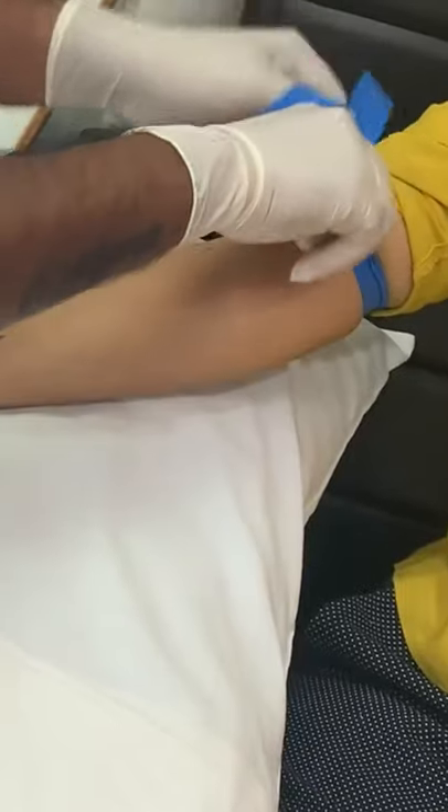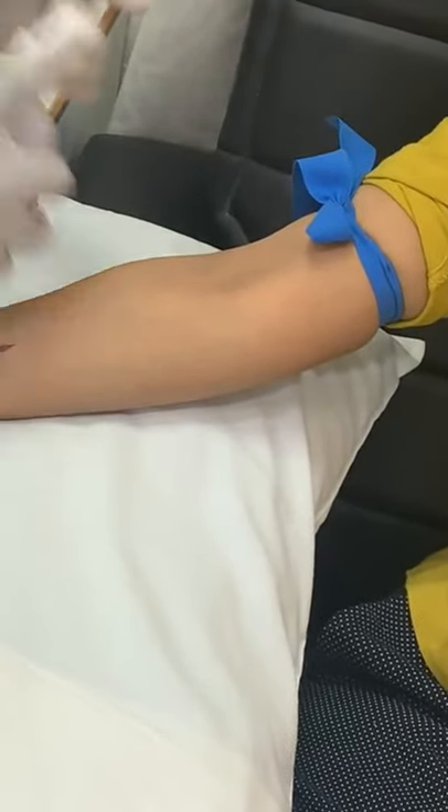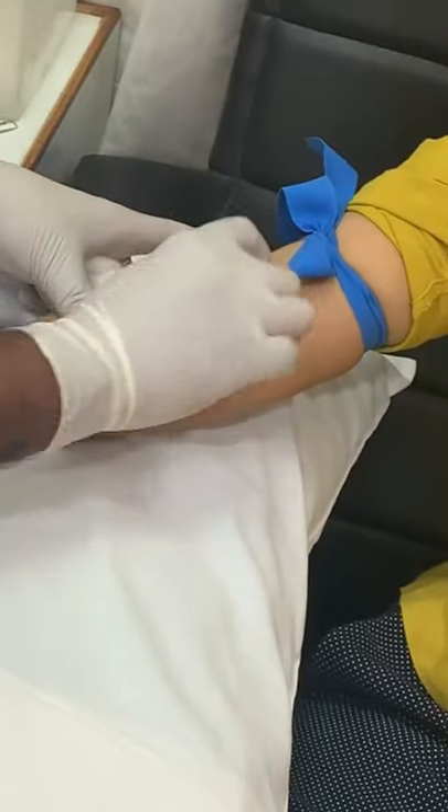Open blood collection. Tie the tourniquet. Clean the area. The precaution is that the cotton should be moved from inside to out.